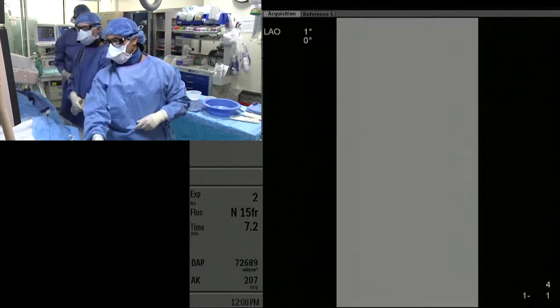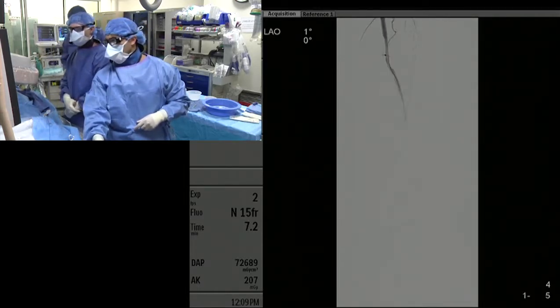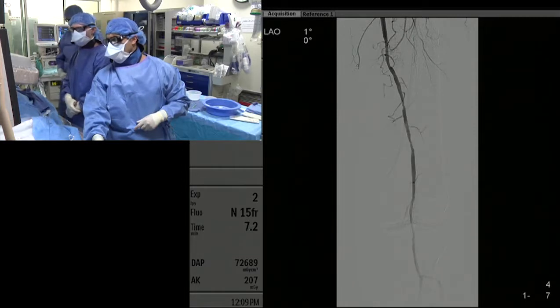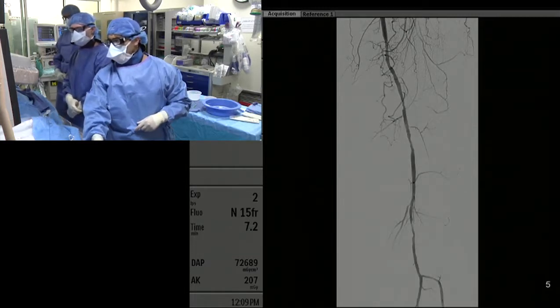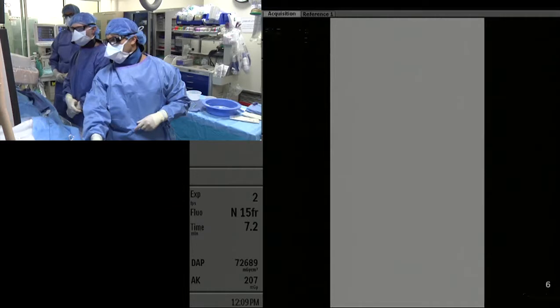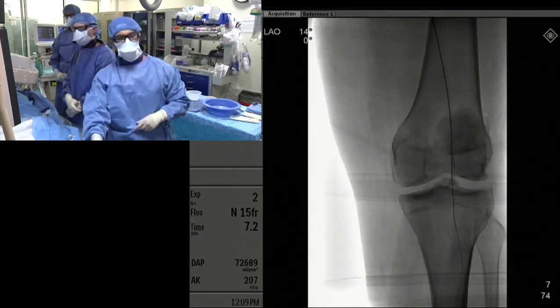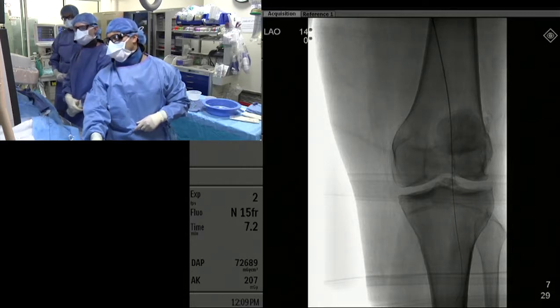There's two-vessel runoff through the peroneal and the anterior tibial artery. After shooting the runoff, we actually wanted to see how far we could get our 150-length catheter.